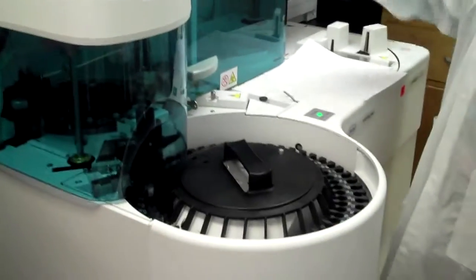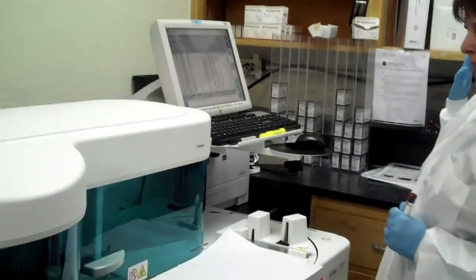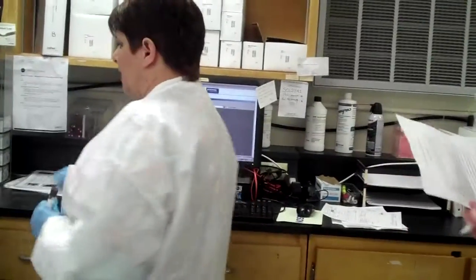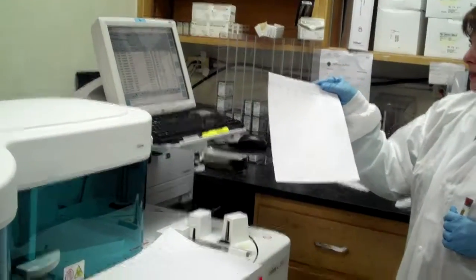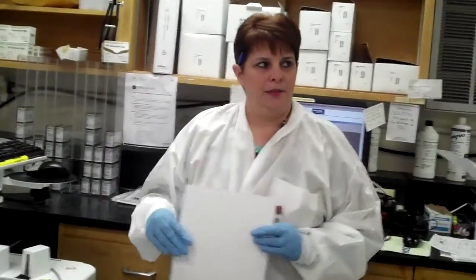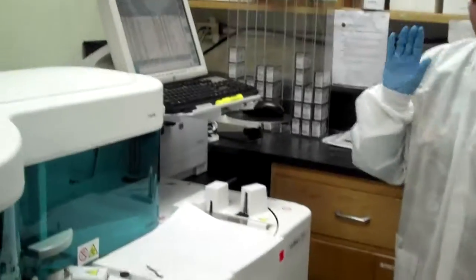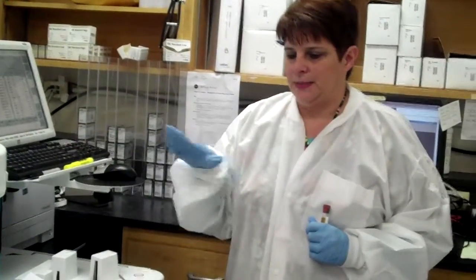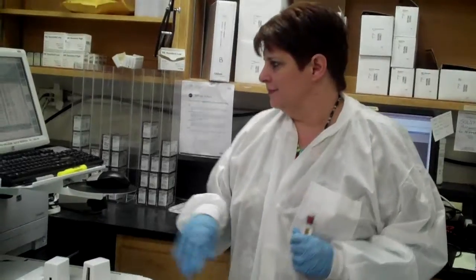And when it's all done, it sends the result over to the instrument computer, and it transmits to a host computer over here. And you get a printout, and the screen will also let you know your patient's done. If you needed to fax this report to the doctor, you could, but most of the time they just look in the computer or in the portal. They get the results, and it's pretty instantaneous. From the time you load a big chemistry profile, it'll do its business for about anywhere from 12 to 20 minutes, and we're going to have the result in the ER if all goes well. So that is chemistry in a nutshell.